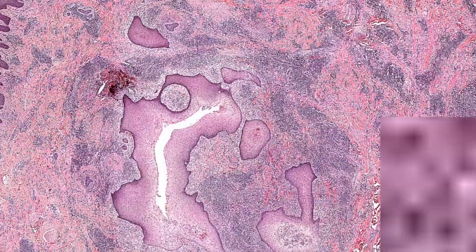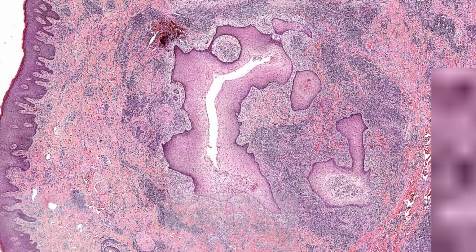I can take this one. As it's coming into focus, I can just see tons and tons of inflammation around what appear to be three, four sinus tracts. They're still out of focus. I know. There we go. Yeah, okay, good.